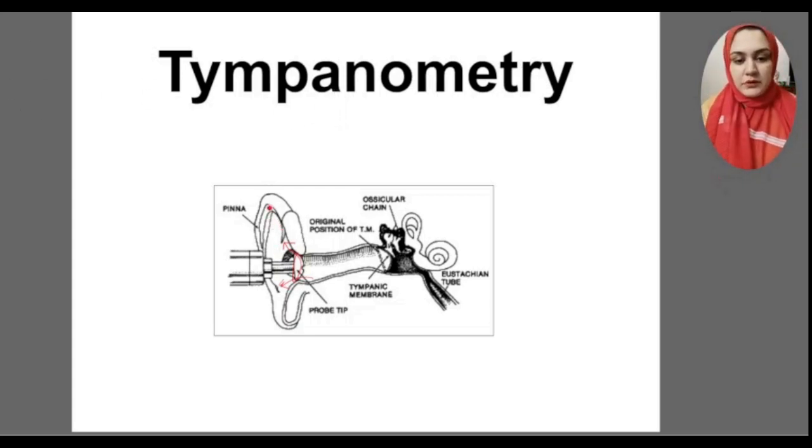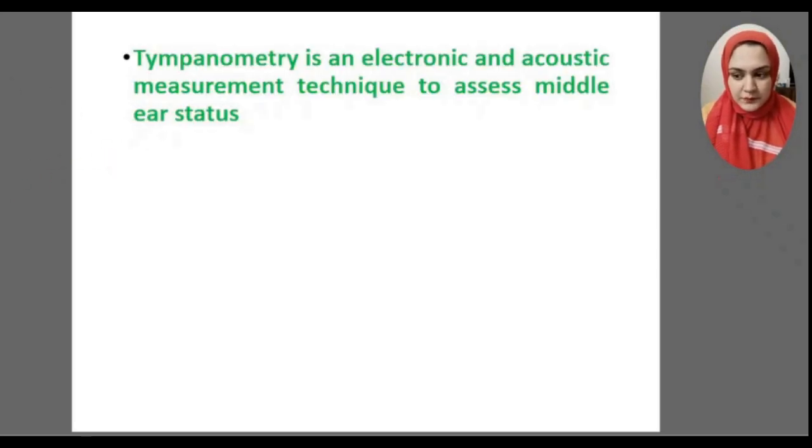Tympanogram or tympanometry is a very useful investigation and it can help us in diagnosing different conditions after we are done with basic ear examination, pure tone audiometry and the tuning fork tests. So this will aid in diagnosing different conditions. So what is actually tympanometry? Tympanometry is an electronic and acoustic measurement technique that is used to assess the middle ear condition.